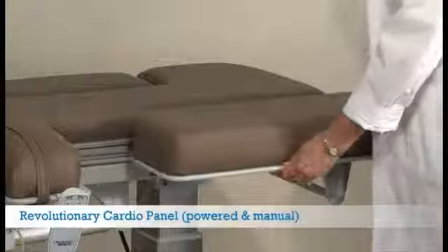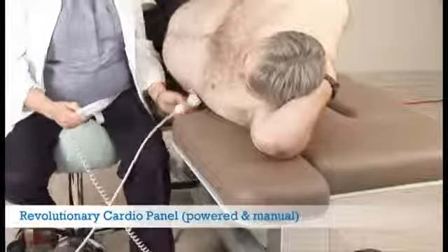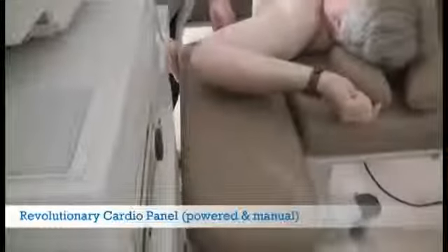Oakworks' patent-pending cardio panel allows you to adjust the size of the opening, ensuring the security of your patient. The powered version quickly moves out of the way for stress tests. Both designs do not interfere with equipment and offer good arm support.